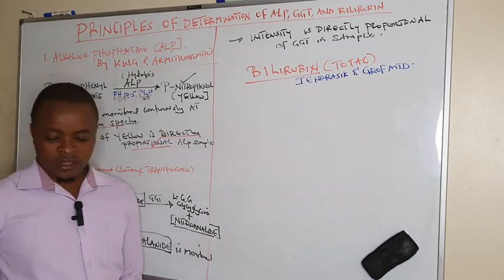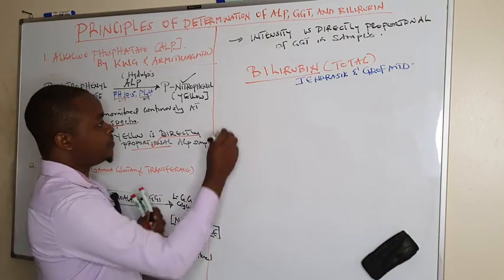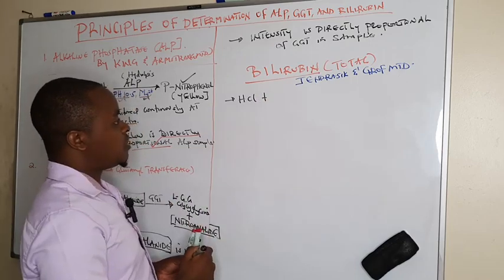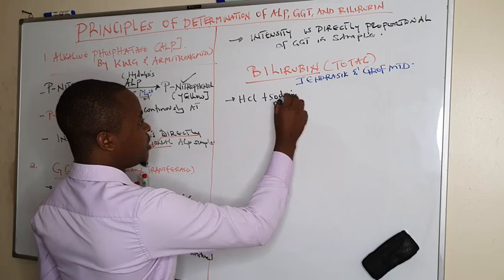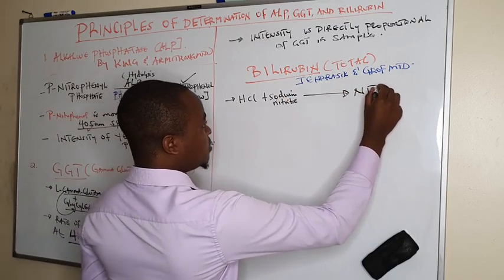And this method utilizes nitrous acid, whereby if we have hydrochloric acid, it reacts with sodium nitrite to form nitrous acid.